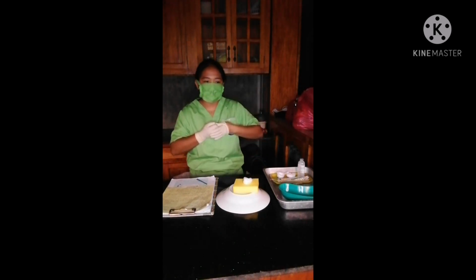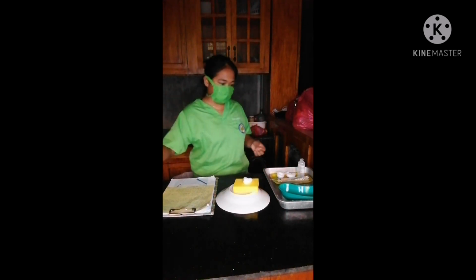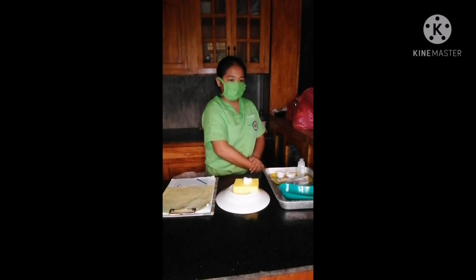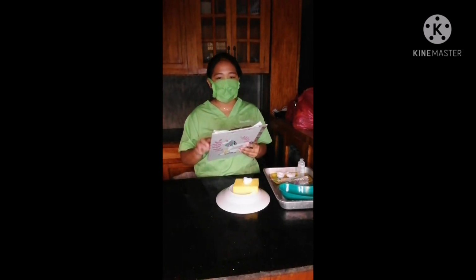Assist the patient to a position of comfort. Remove gloves and dispose of them properly, and perform hand hygiene. Evaluate the response of the patient to the medication within an appropriate time frame for the medication. And then document the procedure in the patient chart.